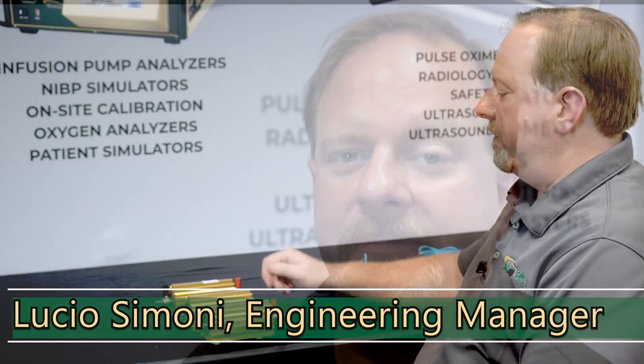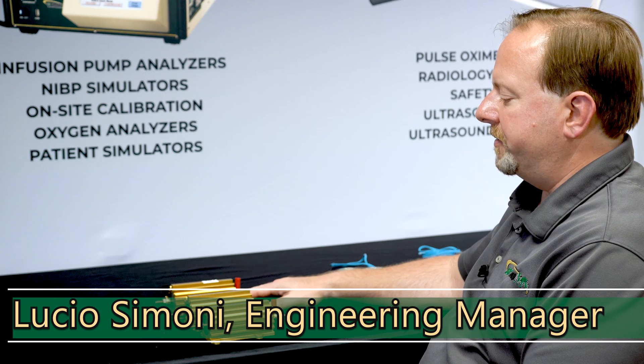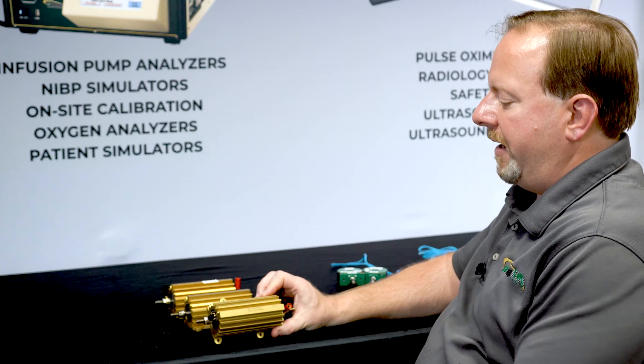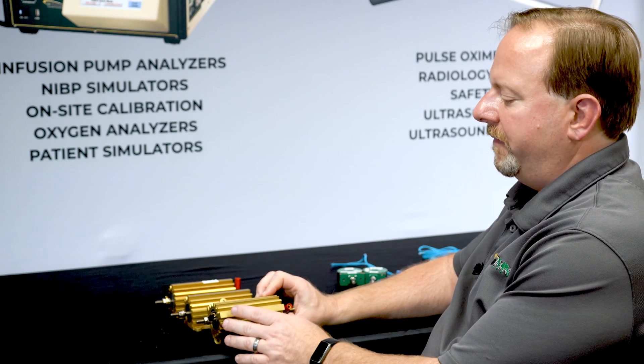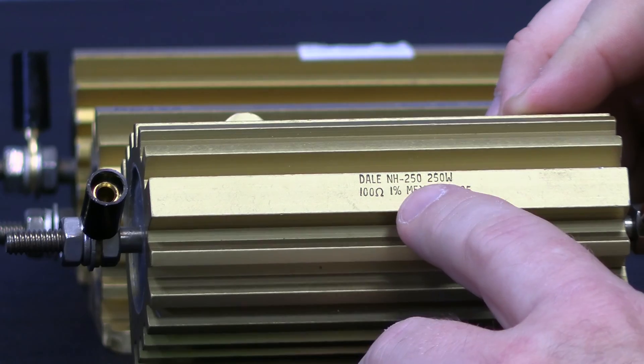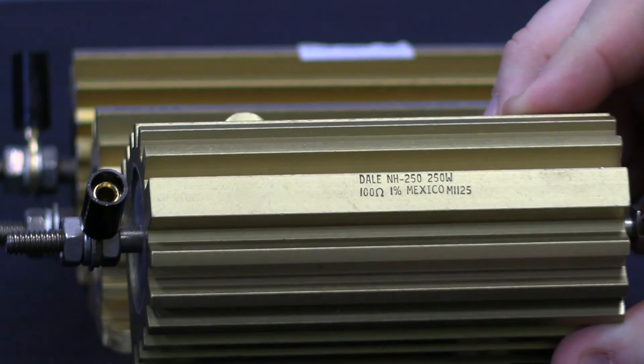In this segment, we're going to talk about the loads that can be used with the ESU 2050 or 2050P. Here we have three typical loads that are used for testing electrosurgical generators. These are manufactured by Dale. They are the NH250 series, so they're 250 watts, non-inductive resistors, and we have multiple resistance values for performing all the testing that you need to do on the generators.